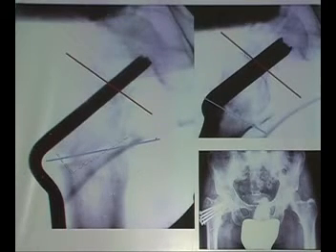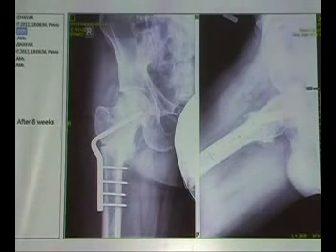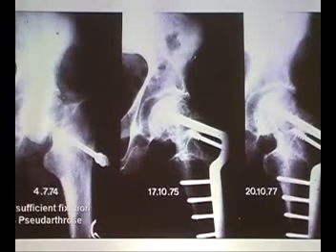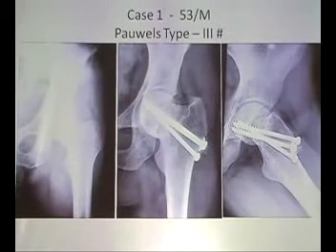Simple, straightforward, very easy. And this is after 8 weeks. No necrosis, the fellow is not yet necrotic, the fellow is walking on it, full weight bearing, free function. So this is the best way out if you have a failure after any kind of osteosynthesis of a neck fracture. And this procedure has stood the test of time for many, many years. I think this was one of my first ones in 74 with the valgus osteotomy, and in 77 you see congruity of the joint, head alive.